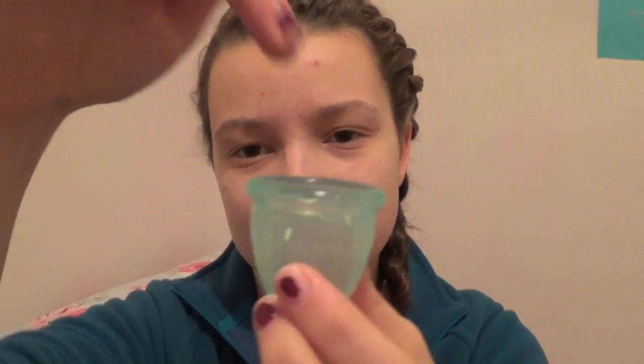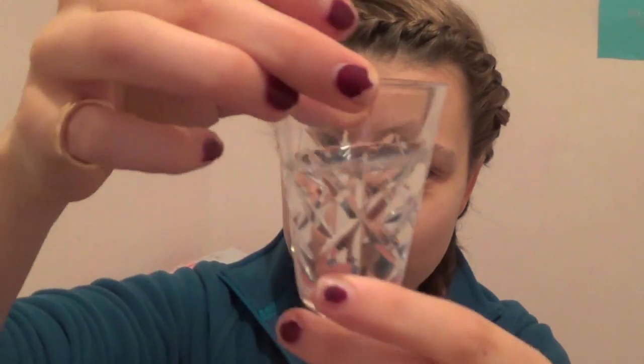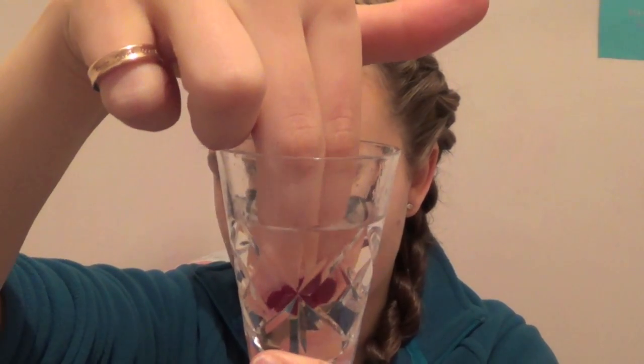When you take it out, sometimes if your cervix drops into the cup like that, you could just imagine, it's a bit like putting a stone into a cup of water. So you can see when you put your fingers into it, the level of water rises, and the same thing happens with your cervix. It drops into the cup and therefore takes up some of the volume of space in the cup and takes away some of the capacity of the cup. But when you take it out, obviously you don't take your cervix out with the cup, so the levels will drop back down again.